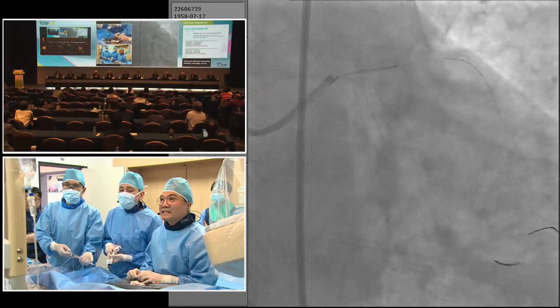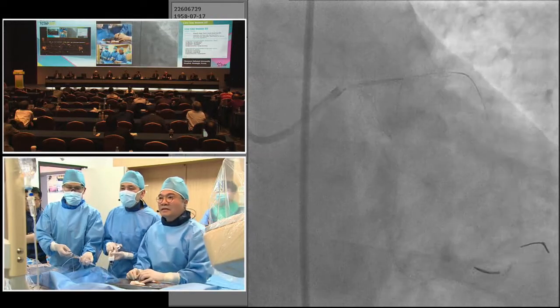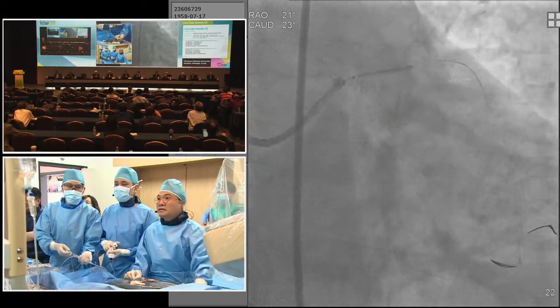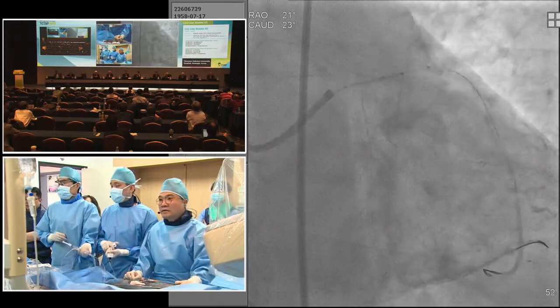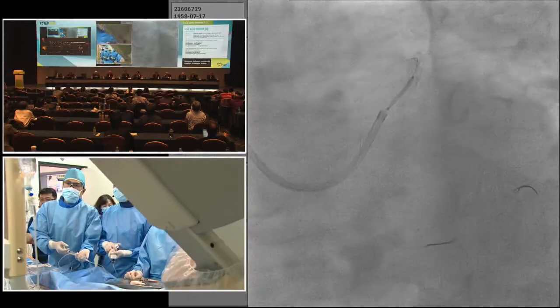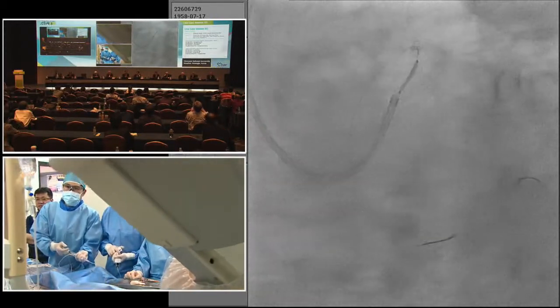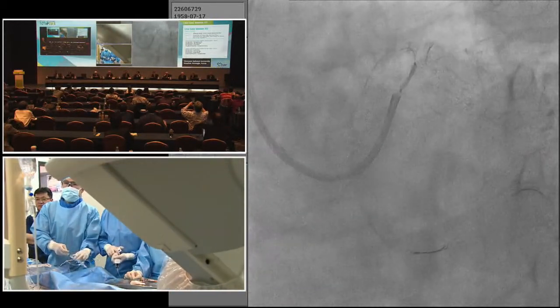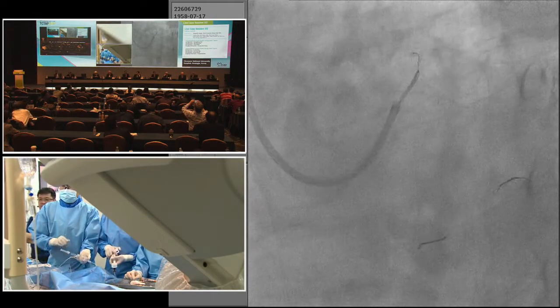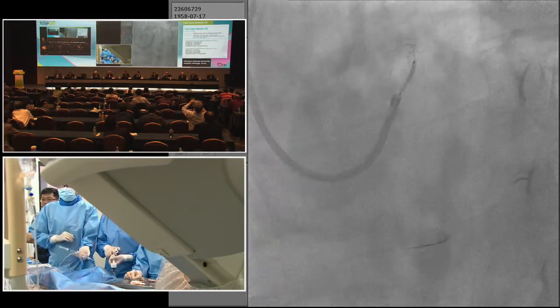Dr. An, check another view. Yes. Spider view may be helpful, right, because it's a spider. It's okay. Very short main. So I think maybe we don't have any good imaging. The other view.